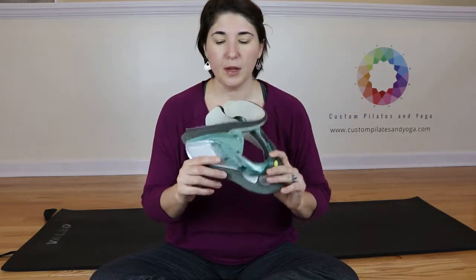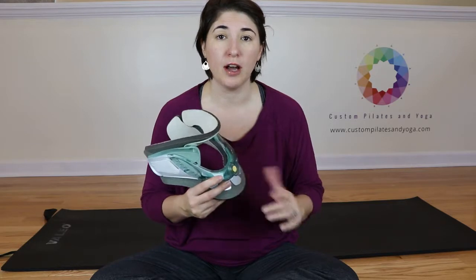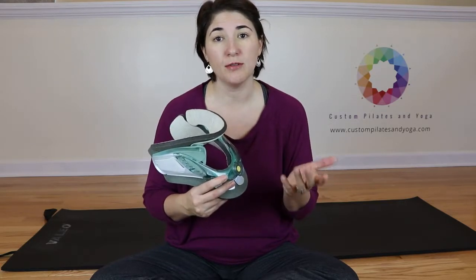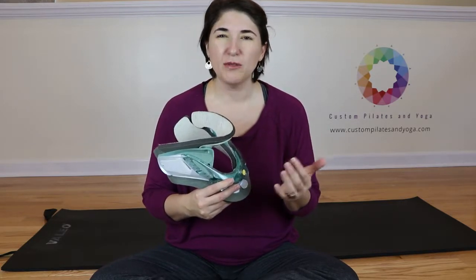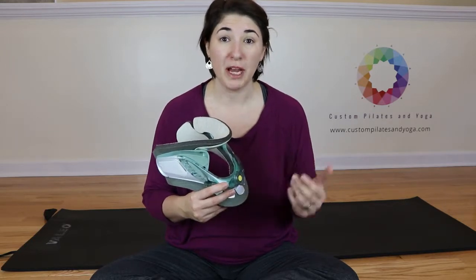Now putting your collar back on can be a tricky thing, and I'm going to walk you through that. When I had my broken neck, I got to take my collar off to take showers, and that was the only time. And it was always a little bit stressful for me because I just wasn't sure when I put it back on if I got it on right.